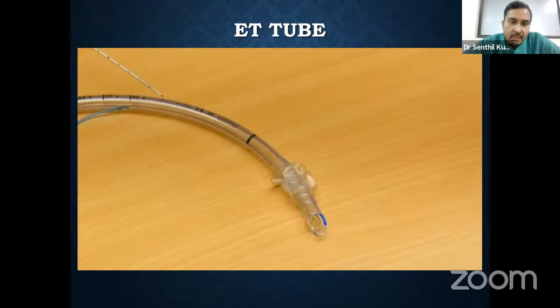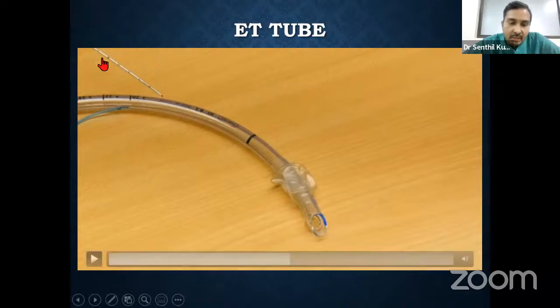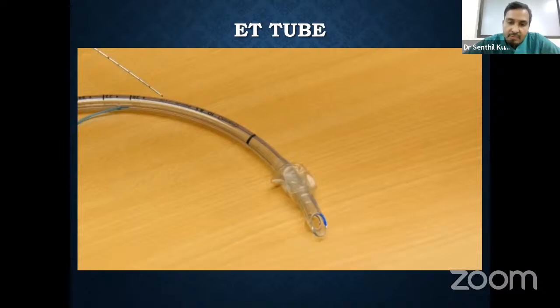So in such cases, it is very important for us, after intubation and after confirming bilateral air entry, to check these markings at the level of an immovable structure, not at the level of the lip. Whenever we fix at the level of the lip, even 1 to 2 millimeters of movement is not going to tell us anything, because the tube might move, and the lip also will move along with the tube. So we are supposed to check at the level of the incisor, or in an edentulous patient at the level of the alveolus, so that the movement can be easily noticed.